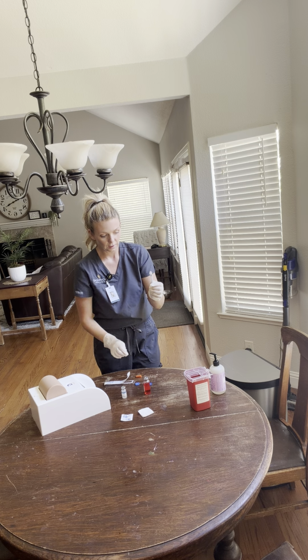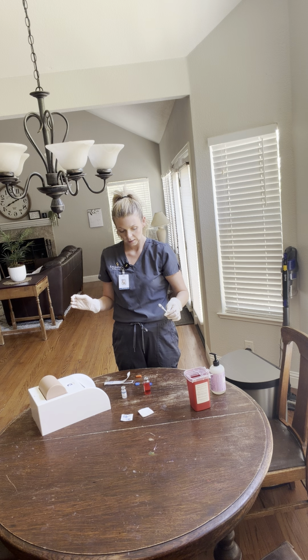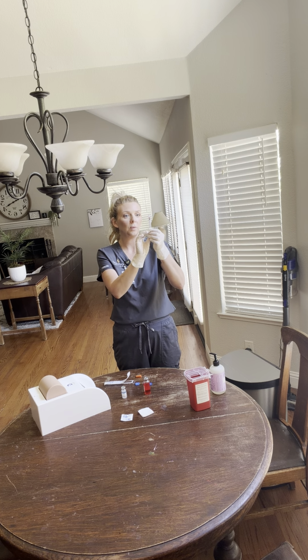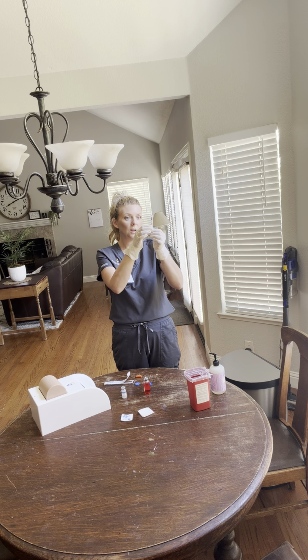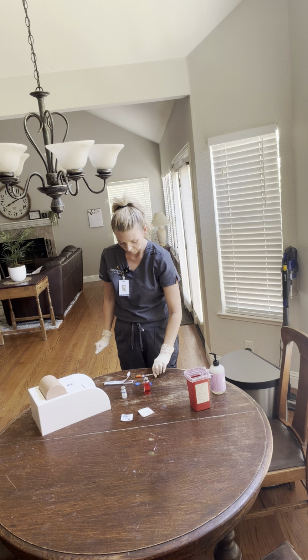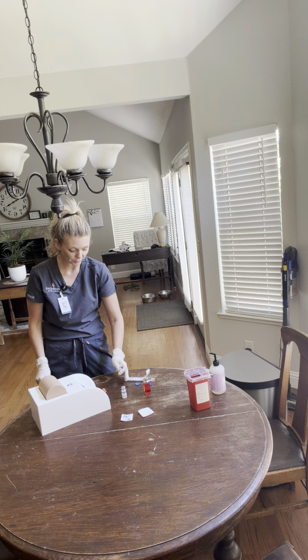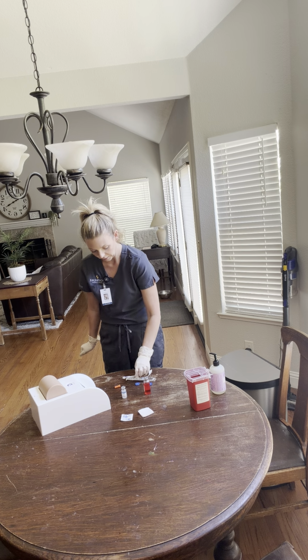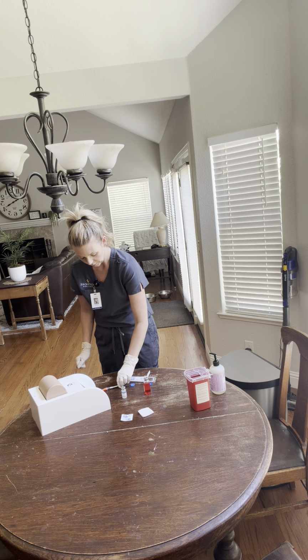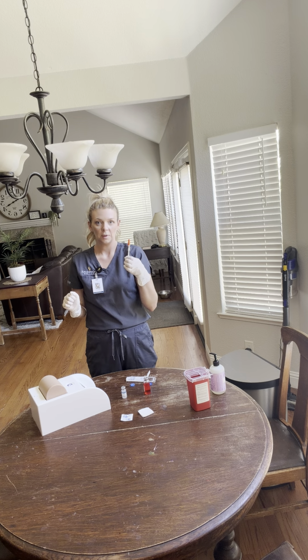Okay, and using the scoop method, I'm going to, with one hand, first make sure that there's no air bubbles, and I see just a couple of air bubbles, so I'm just going to expel those very quickly, and I'm still looking good at 12 units. I'm going to take my one hand, and I'm going to cap the needle, one hand method, I'm going to cap my needle like so. And this is now ready to be administered.